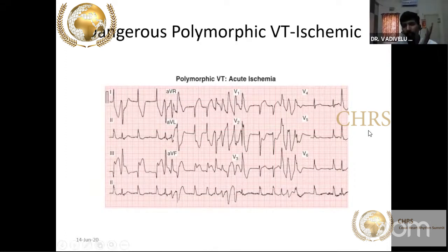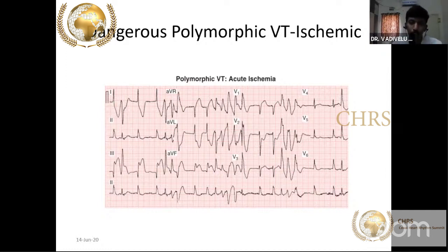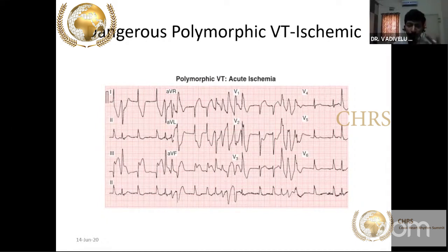Polymorphic VT is when QRS morphology and axis are changing. Polymorphic VT in a patient with chest pain always indicates acute ischemia. Monomorphic VT has regular QRS, regular axis, regular morphology — monomorphic VT in a patient with CAD history means the MI occurred in the remote past, due to scar and re-entry phenomena, not typically in the setting of acute coronary syndrome.